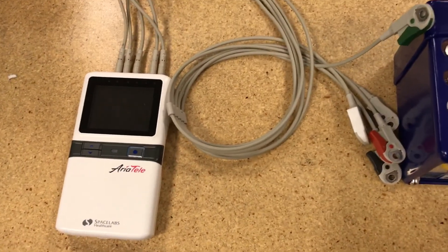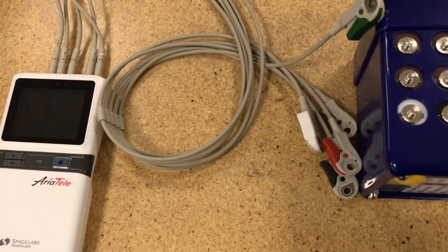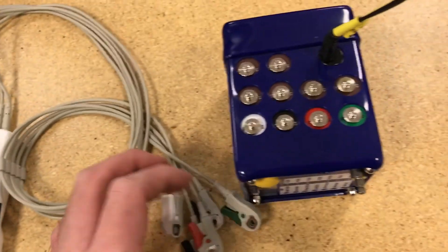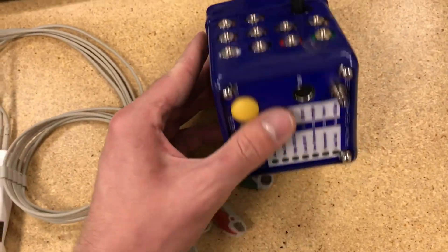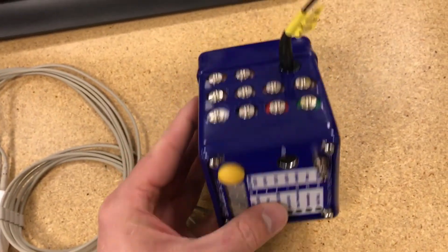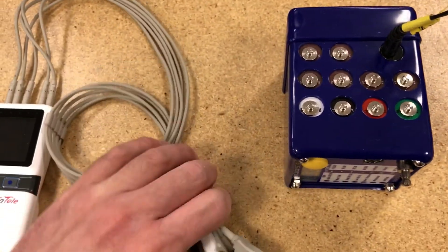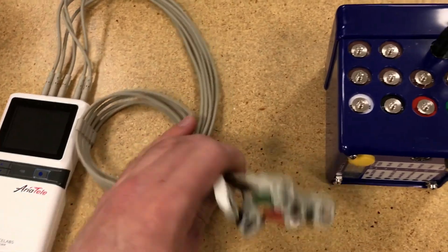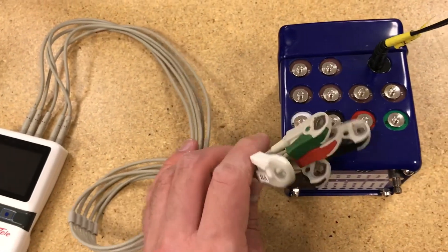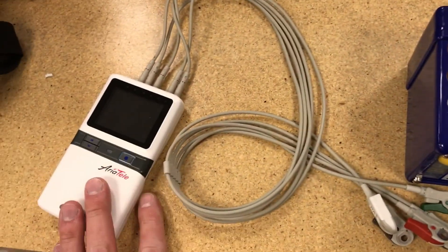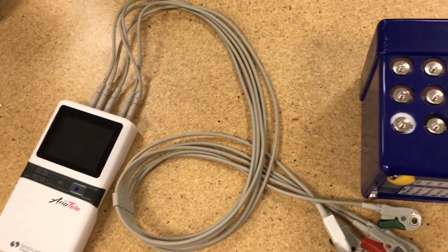So if we're using these, you can wire them up pretty similar to how you would wire up an ECG to a patient. For this, I'm going to be using the patient simulator. And just like with the other one, match the color codes. And from there, you can put the batteries in and start transmitting.